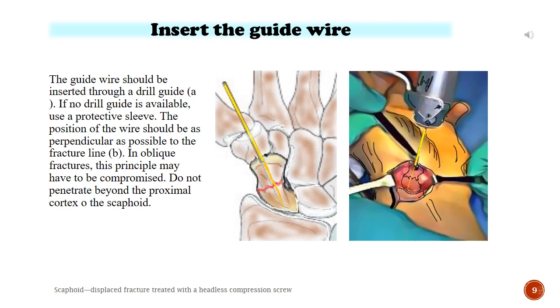Insert the guide wire. The guide wire should be inserted through a drill guide. If no drill guide is available, use a protective sleeve. The position of the wire should be as perpendicular as possible to the fracture line. In oblique fractures, this principle may have to be compromised. Do not penetrate beyond the proximal cortex of the scaphoid.